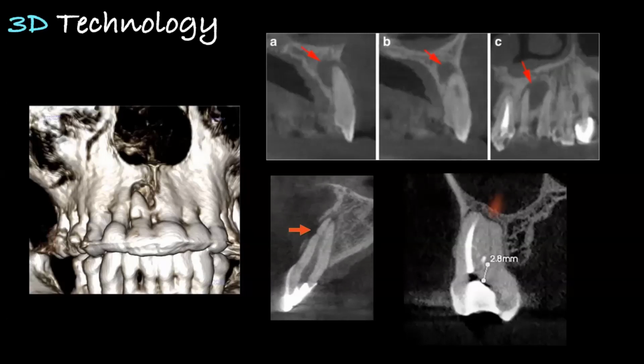And when you're doing endodontics and you say, why does this tooth still have problems? Well, you can visualize where you missed a canal. You can visualize where there is an extra canal. And there's lots of this information that is really valuable that will help you on a day-to-day basis in your practice. And when you have a tooth that's having problems, the three-dimensional rendering, which I utilize every day, really helps to show you that, hey, listen, this is a blown out tooth. It looks like it has external resorption, and it needs to come out.